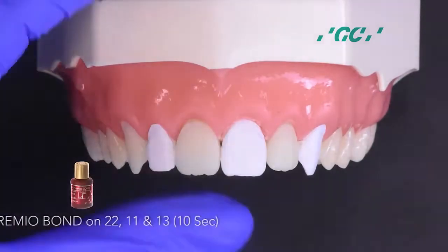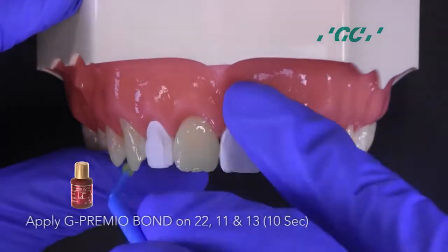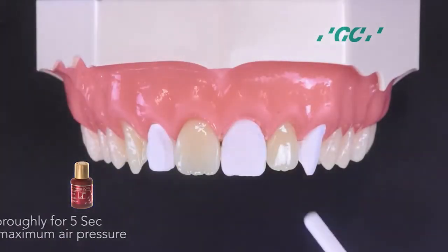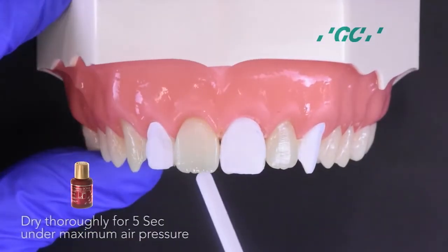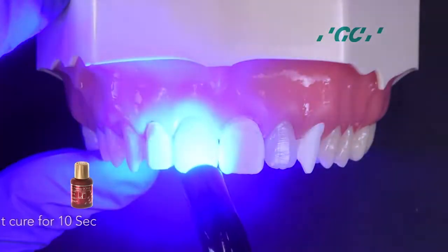Next, isolate 1-2, 2-1 and 2-3 with plumber's tape. Apply G-Premio Bond on the adjacent teeth. Dry with maximum air pressure for 5 seconds, then light cure for 10 seconds.